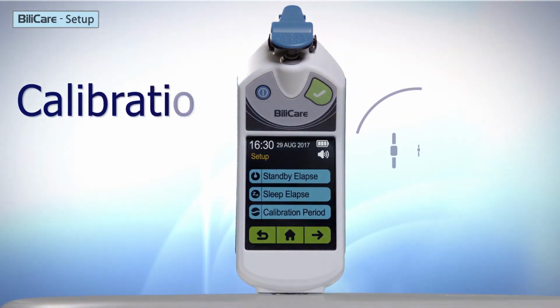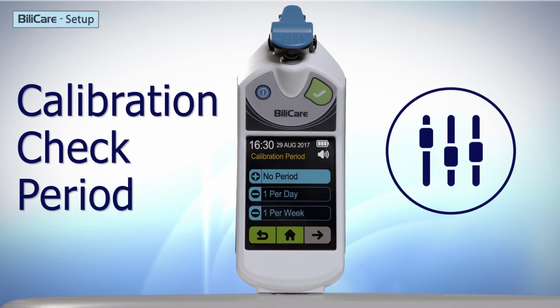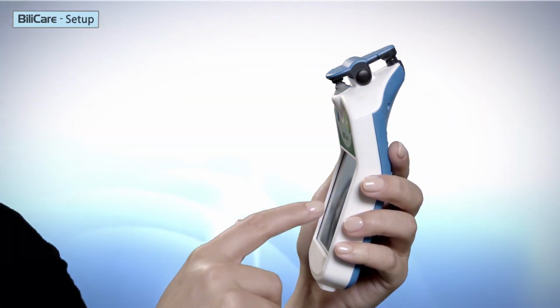The Calibration Check Period menu determines the time between the calibration checks. The default is no period. Once per day or once per week may be selected.